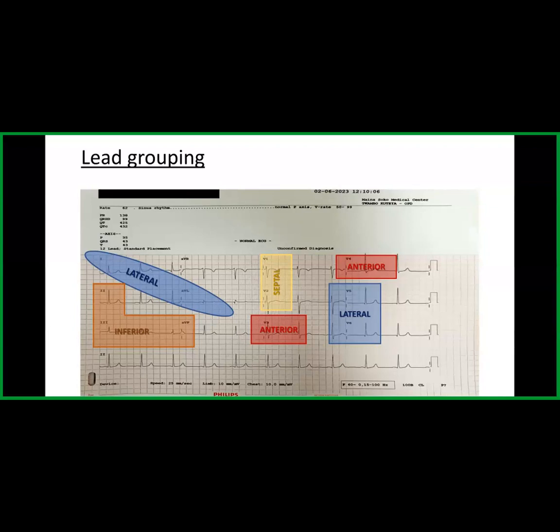So when we're talking about the high lateral leads, they are supplied by the circumflex artery.